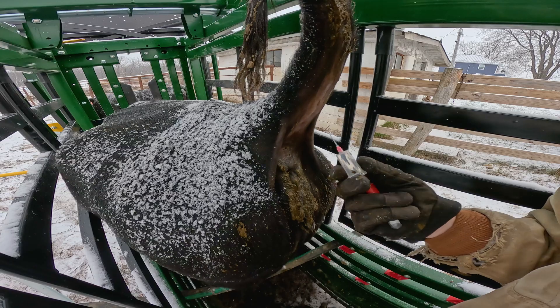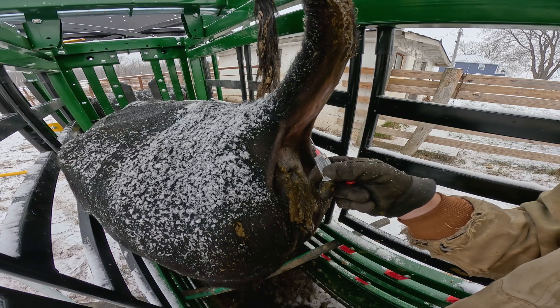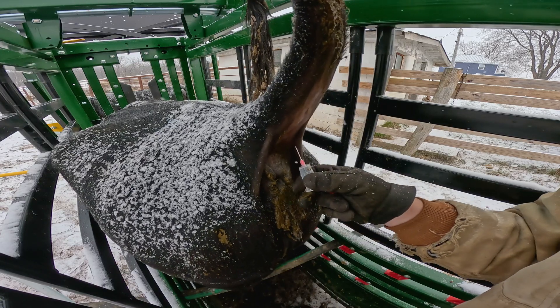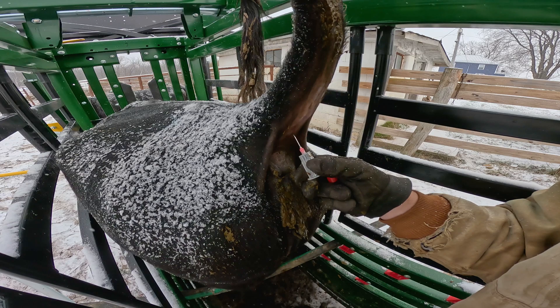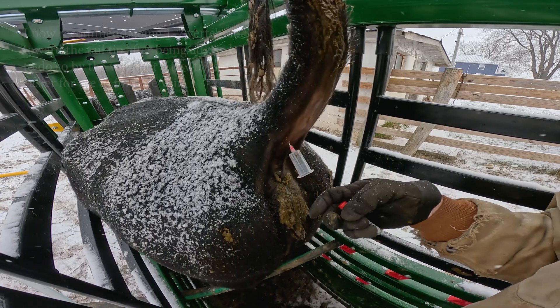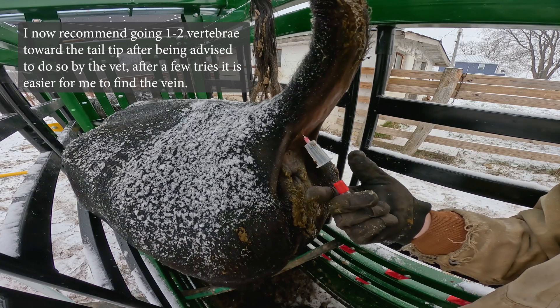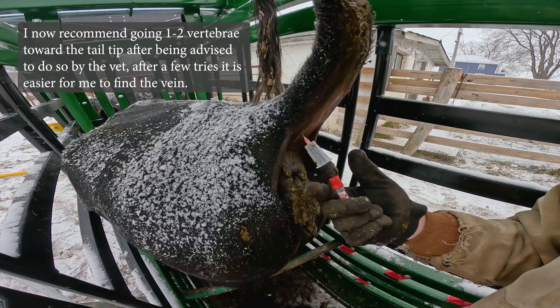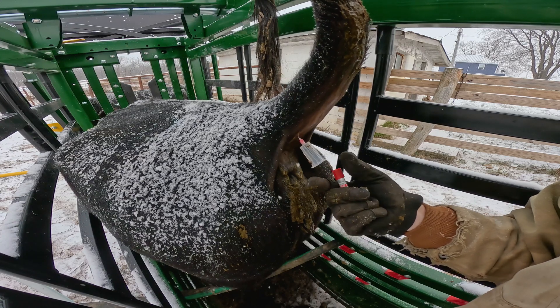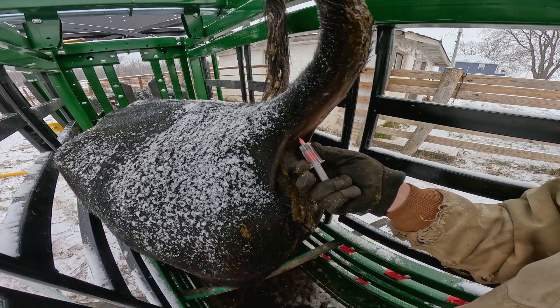One thing you also want to make sure you don't do is go straight in — you want to go up at a slight angle. That's something I forgot to do for the first few cows this year, and it went a lot smoother once I started going at a roughly 45-degree angle up. So we're going to go right in the middle of the tail, right in the middle of that dip. We're searching for a vein. You go in until you can feel the vertebrae — usually you want to stop right there. You don't want to push anymore. If you don't get any blood out, you can pull the collection cup back a little bit. I'm going to go ahead and put the tube on.